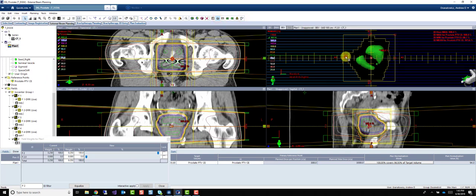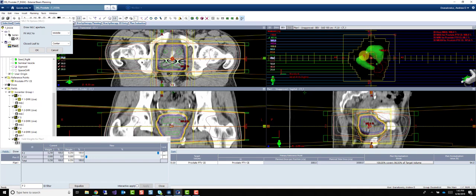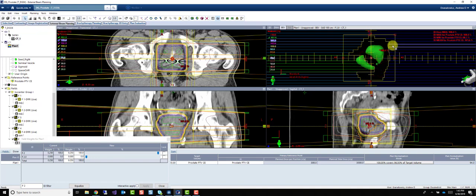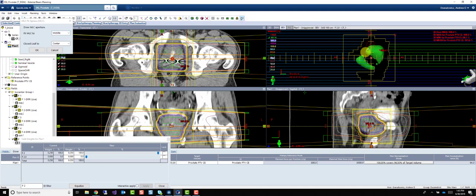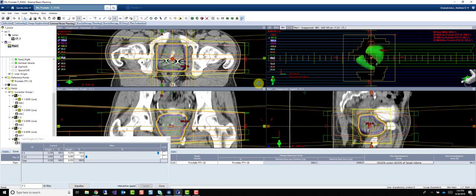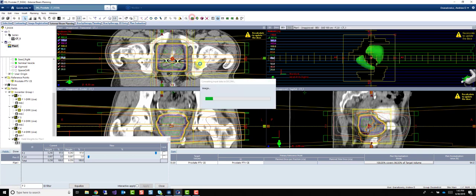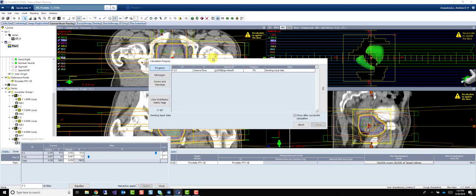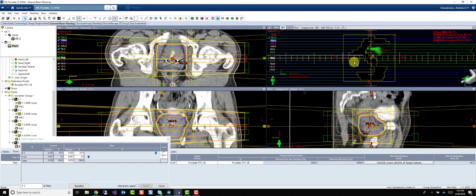I'm going to try blocking this 107 from our X1 side. I'm going to get this from our X2 side. Add 3%. Let's see what happens. You can see that 107 shrank considerably, so that's good.